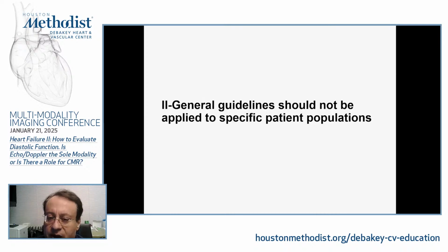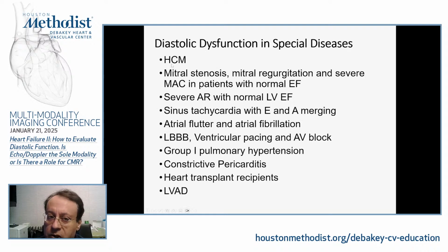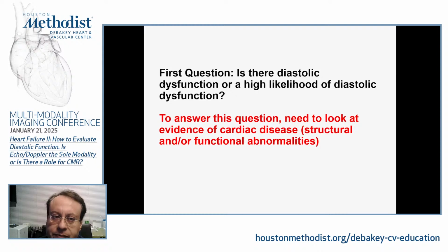So there are also specific patient populations that pose challenges, and when we think of a guidelines-based approach to assessment of left atrial pressure and diastolic function, it depends if you're looking at a case that belongs to one of these specific populations or not. And they are listed on this slide. It doesn't mean that when we see patients with these conditions, we don't assess LAP or we do not aim to assess LAP. It just means we have challenges and we have a different approach from the general approach that I will be sharing with you now.